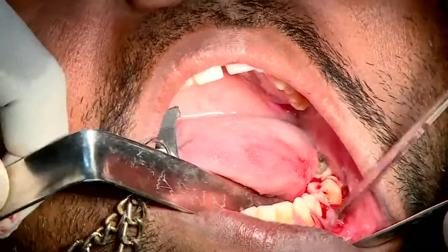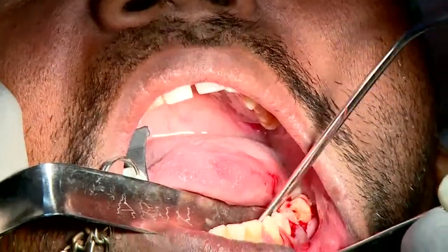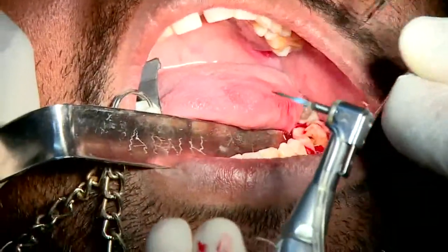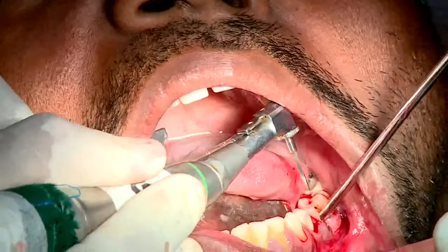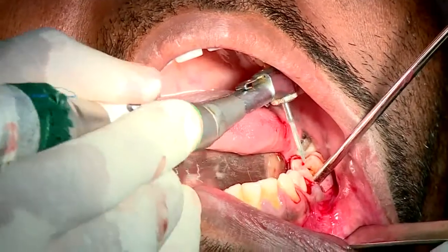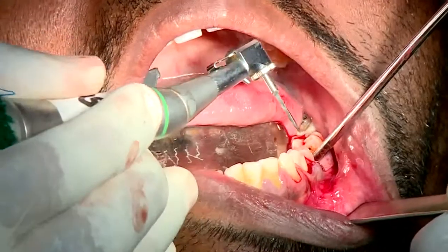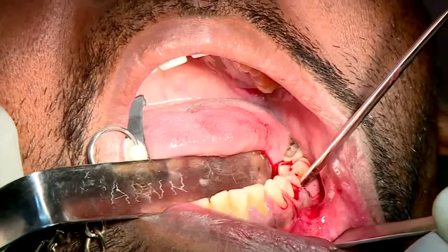These are cooled burs, which means they have an irrigation pump there, and that irrigation pump and the tubing are built in. So when I press my pedal, the irrigation is on. Yeah, irrigation is on.